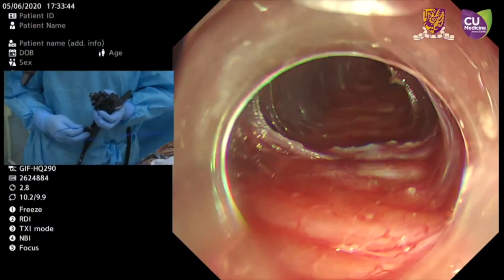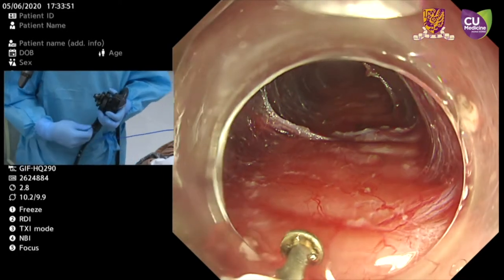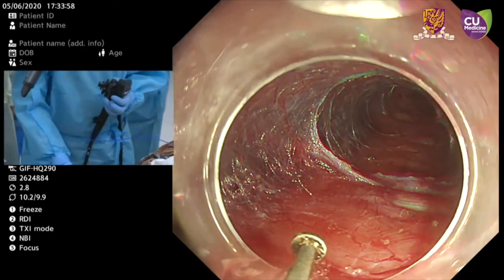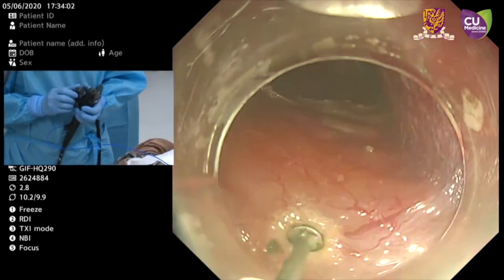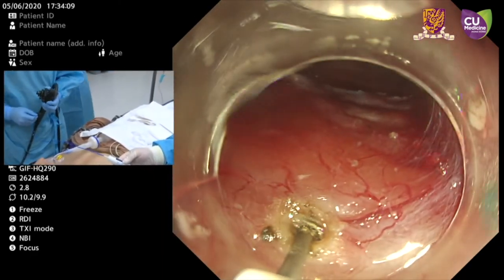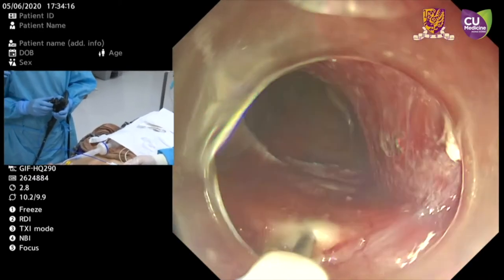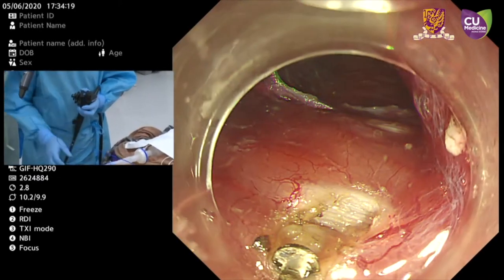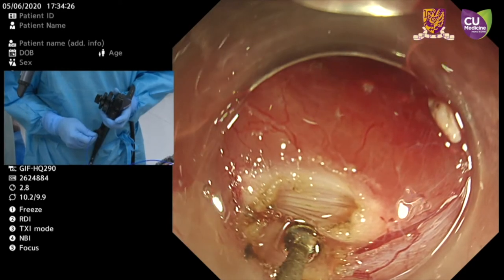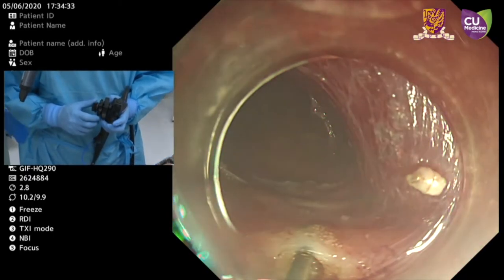We started the inner circular myotomy. I'm now using the hybrid knife, T-type. Now I'm starting to dissect with the EndoCut mode, with effect 3-2-4. Very important: at the very beginning, the first cut should be located around one centimeter below the mucosal incision so that the inner circular myotomy won't overlap with the mucosal incision. After you can see the inner circular muscle fiber, I would use the T-type hybrid knife to hook it up and perform the myotomy.